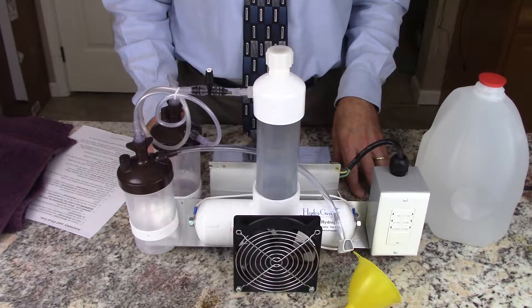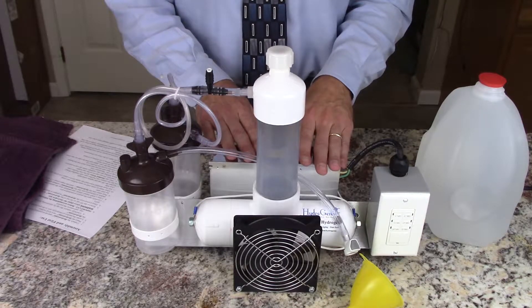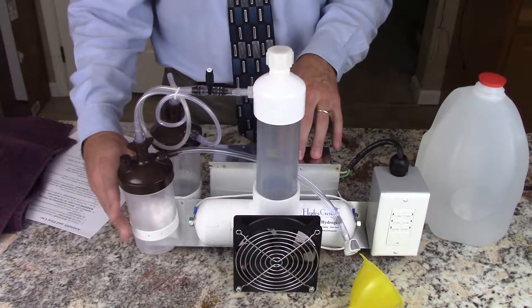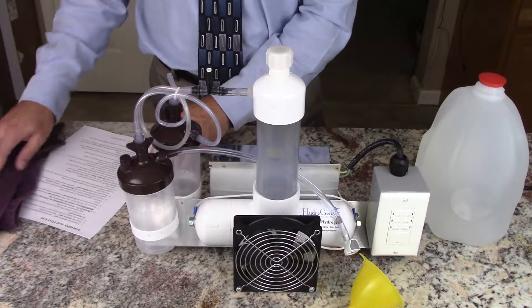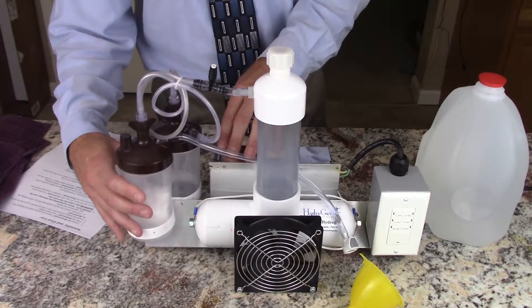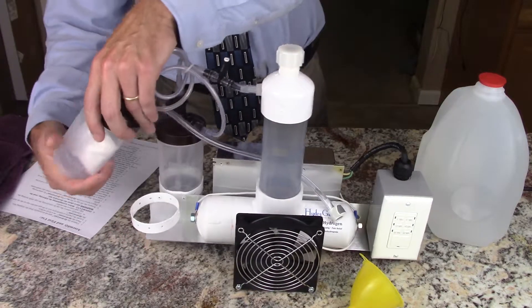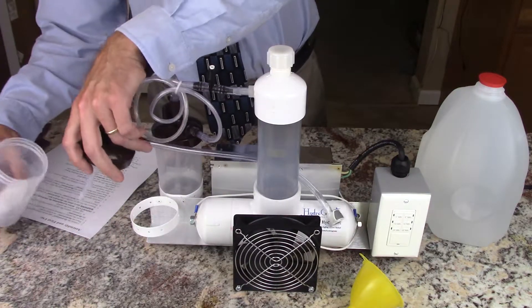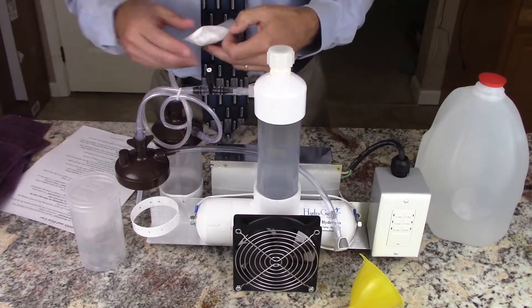The next step is to place the HydroGene on a level surface and locate the packet of electrolyte mix. I'm following the assembly and first use instructions on this sheet of paper. The packet will be in one of the bubbler cups for safety while it's transported. Just unscrew the cup, take out the packet and you can leave the cup set aside.